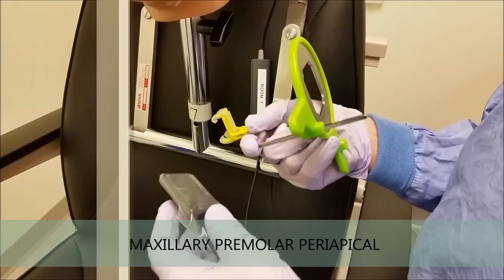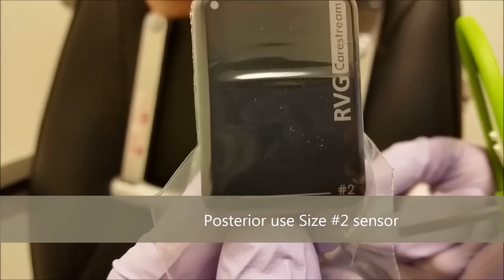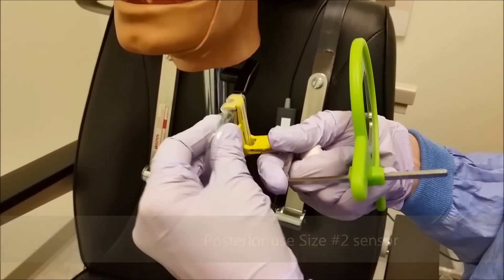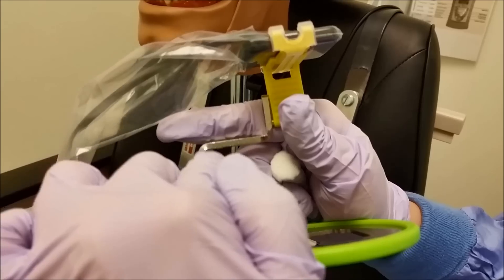For posterior positioning of a periapical, you're going to need your size 2 sensor. You're going to want to place it in your instrument in the bite block like so, with the cord coming out at kind of an angle — the same way that the angle of the bar is.